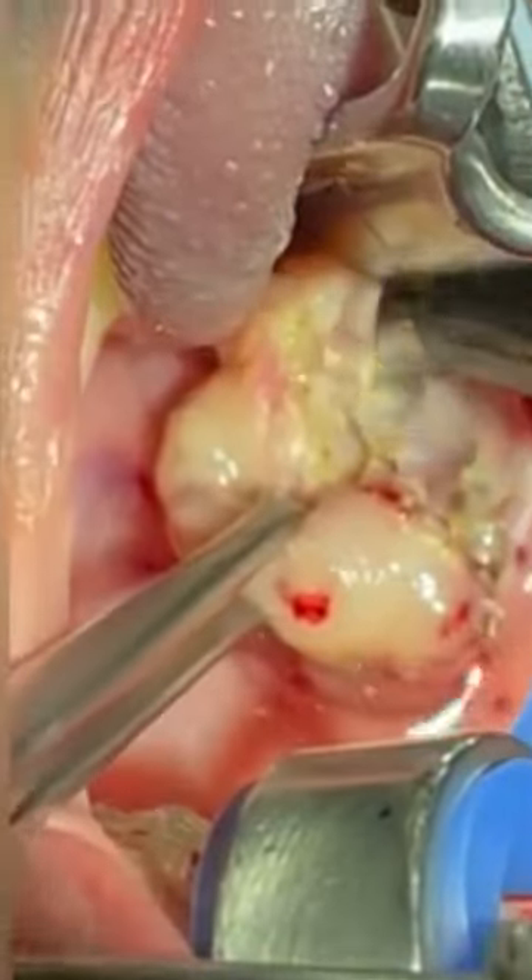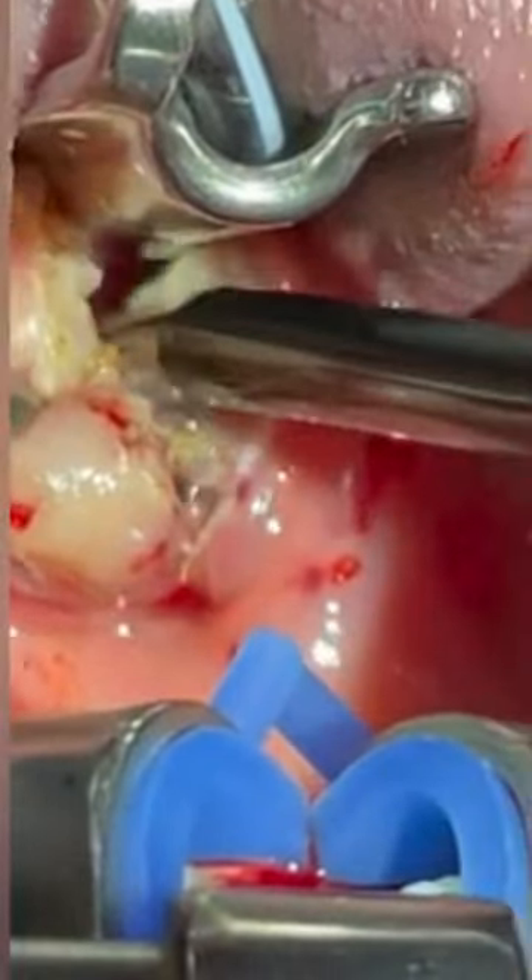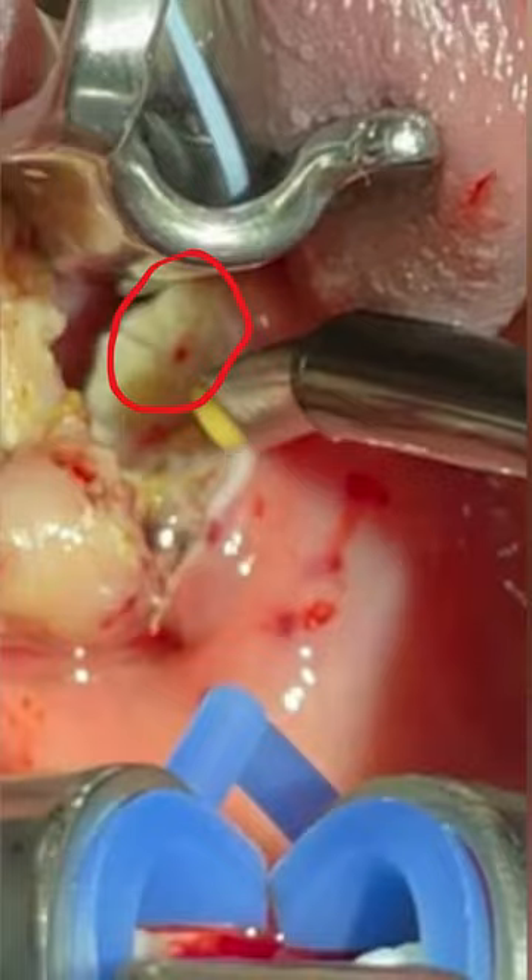And for this reason, it's able to go right through the tonsil. But again, tonsil tissue is being left behind, as you can see right here. And also right here.